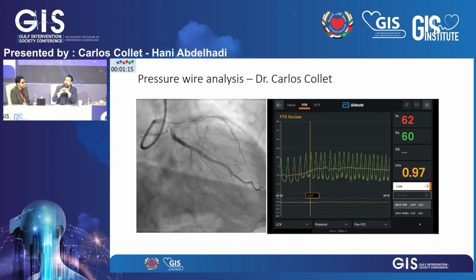And exactly the opposite happens in the right coronary. Because when you're lying down, the right coronary goes down, and then you get the column of water influencing the pressure of the distal sensor, which is elevated. I usually say to my fellows, when they put a wire in the RCA and say, listen, it's not well equalized, the FFR is 1.03, I say, no, that is well equalized. That is normal. The pressure distally is higher than the pressure proximally. So these are nuances, but I think the more we do, the more we understand these small details of physiology.